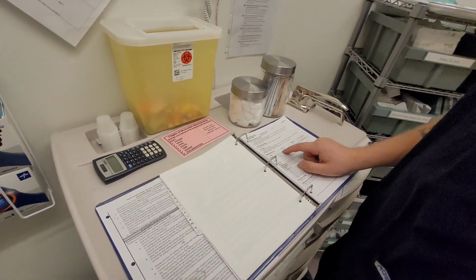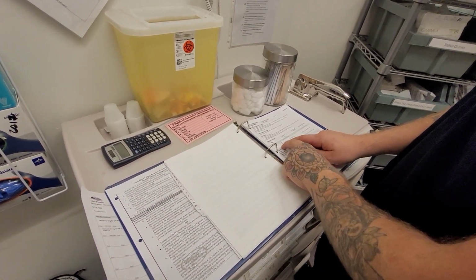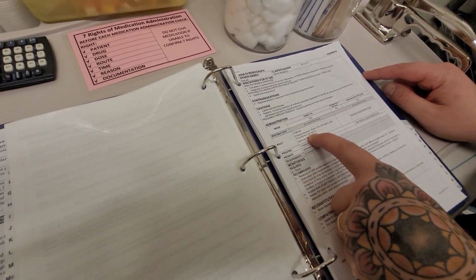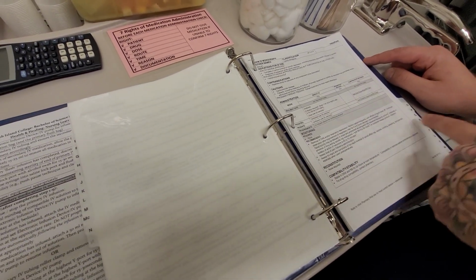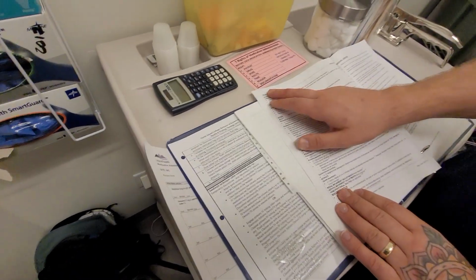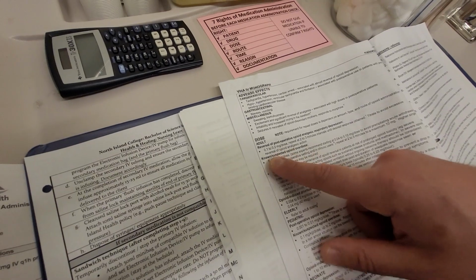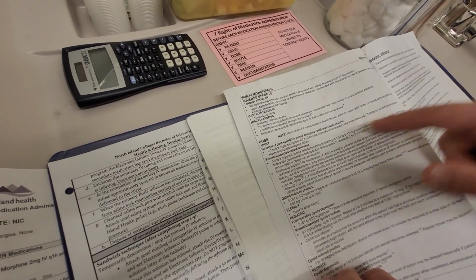We're going to see if we can even give it direct IV. Yes, we can. We can give it undiluted, but today we're going to be diluting it. So we're going to take 1 ml of our medication with 9 ml of normal saline for a total concentration of 0.04. We're going to give over 30 seconds. We've got a compatibility that we're going to check at the bedside, make sure that that's all good to go there. We're going to be looking at our dose effects here, monitoring at the bedside, and then we're also going to take a look at our dosage. So 0.1 milligrams to 0.2 milligrams, 2 to 3 times, repeat at 2 to 3 minute intervals until our desired response.